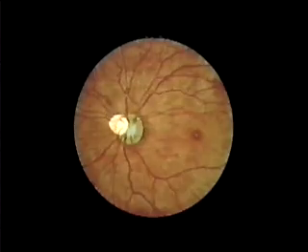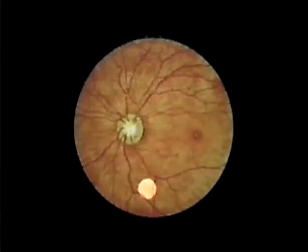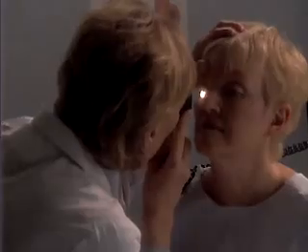Note the relative size and color of the narrower, lighter arteries and the larger, darker veins. Look for changes, such as nicking of the veins at arteriovenous crossings. There should be none. Examine the surrounding retina for hemorrhages or exudates, noting their size, shape, color, and distribution. Again, there should be none.